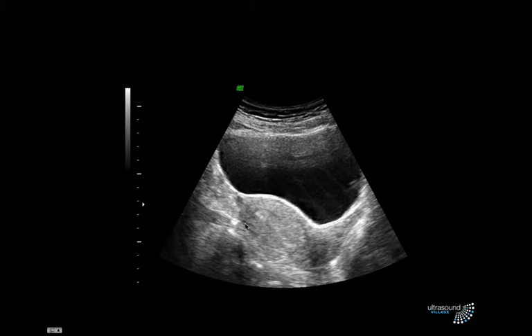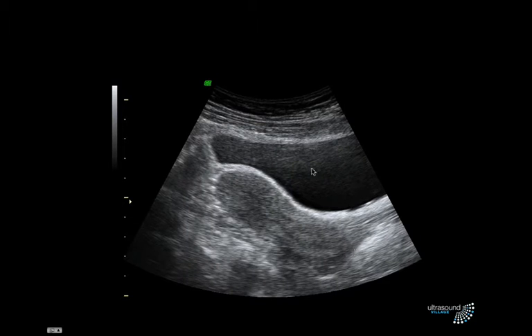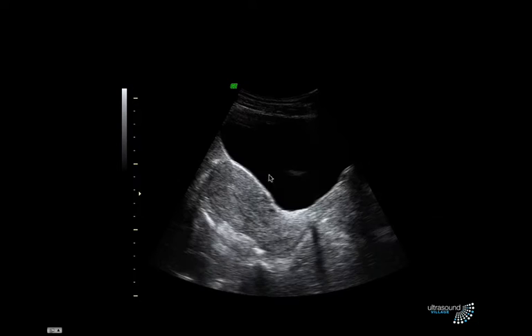Now, to confirm that that's a uterus, how do we make sure that that mass is a uterus? Well, the uterus attaches to the cervix, attaches to the vagina. If whatever mass you're looking at has an endometrium in the middle and is attached to the cervix and attached to the vagina, it's definitely the uterus. Here's another one. Bladder, uterus, vagina. Bladder, uterus, cervix, vagina, rectum behind.